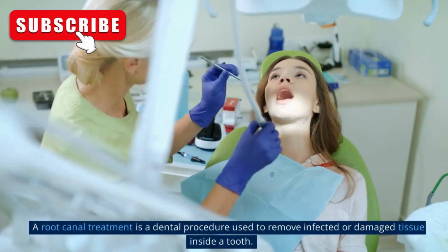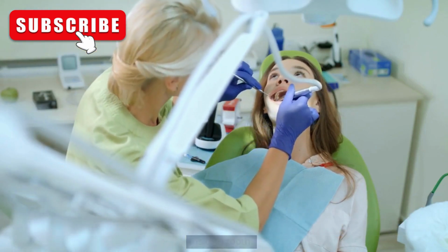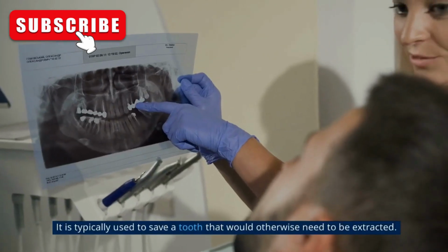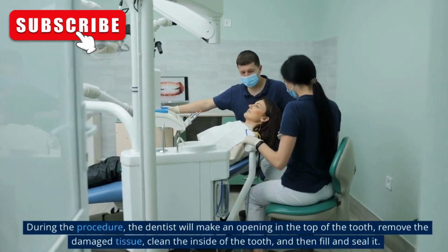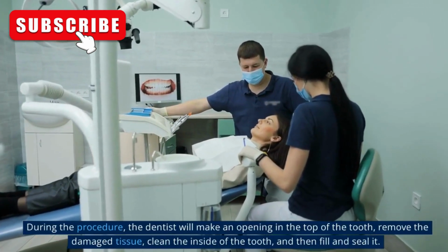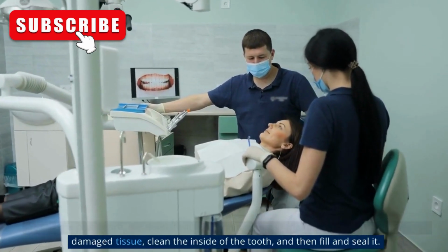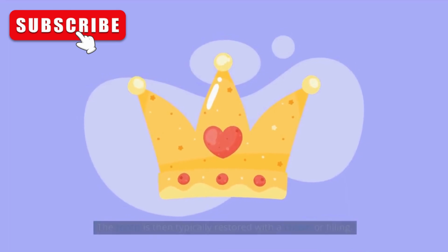A root canal treatment is a dental procedure used to remove infected or damaged tissue inside a tooth. It is typically used to save a tooth that would otherwise need to be extracted. During the procedure, the dentist will make an opening in the top of the tooth, remove the damaged tissue, clean the inside of the tooth, and then fill and seal it. The tooth is then typically restored with a crown or filling.